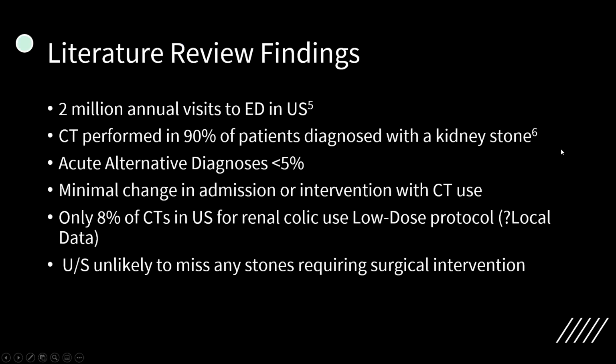Basically the main things, they found it's a common problem with millions of annual visits to emerge in the US per year. And interestingly, they found there in the States that in patients who end up with a diagnosis of kidney stone in the emergency department, a CT was performed in 90% of those patients. So kind of looking at our results from a little poll I did, a lot of people were saying POCUS, but it looks as though it doesn't say whether or not POCUS was done, but at least the CT was performed in about 90% of these patients. So that's a really, really high number.